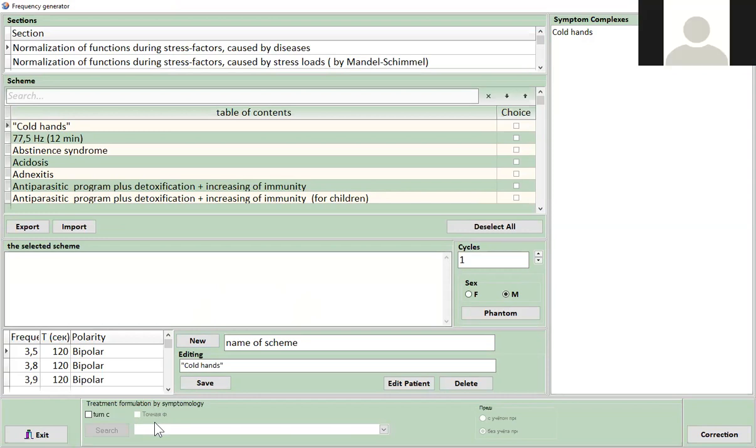So you don't even go through the diagnostic with him. You just generate the magnetic strips and give those to him for what he wants. I just generated them, because these frequencies are basically the same for everybody. They have the same modulation. Okay. Mm-hmm.